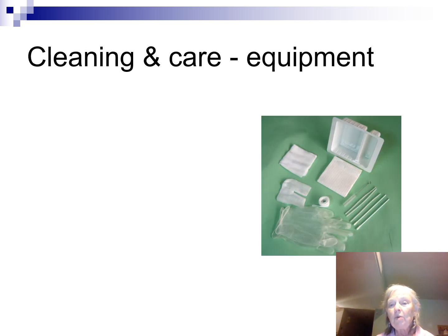So we had at one time some really sophisticated, really nice cleaning kits, and you can see one here. This kit has at least two areas, sometimes three areas in it. You have some sterile field to be able to put your sterile equipment on. You have some gauze. You also have a gauze that's pre-cut. You have a trach tie at this point.